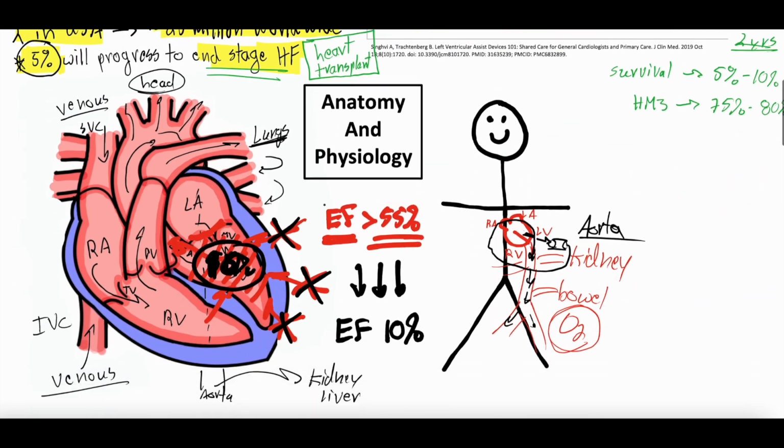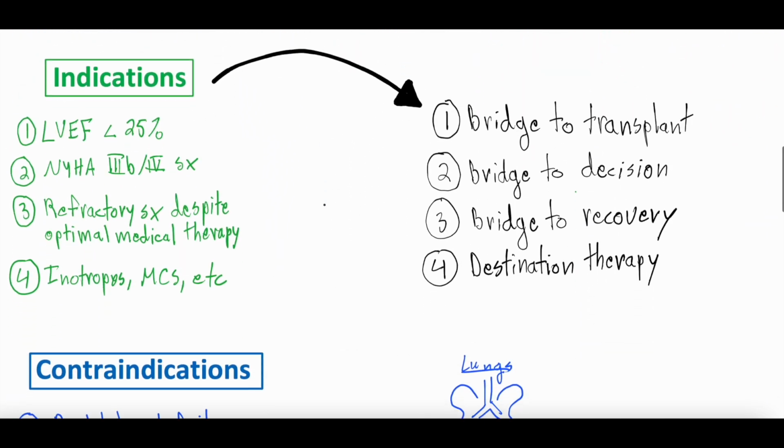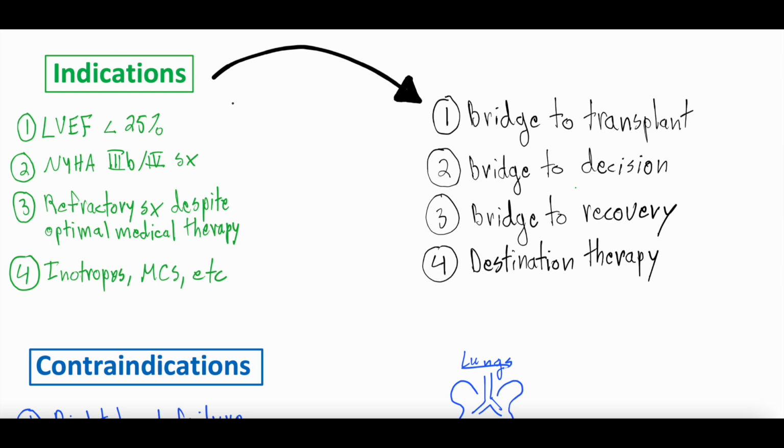Okay, so we talked about the anatomy, physiology. We talked about what that looks like. What are the indications? Who benefits from an LVAD, right? I told you there's an increased survival at 2 years, okay? There's decreased symptoms for many people with end-stage heart failure.